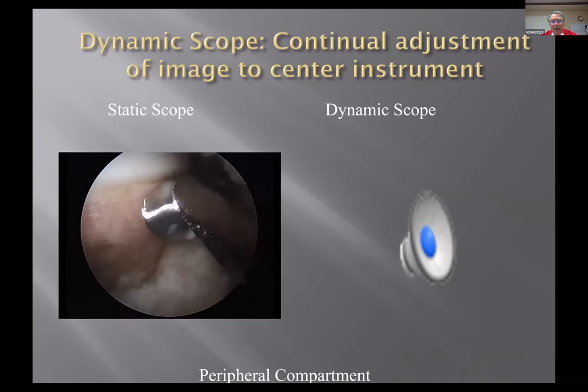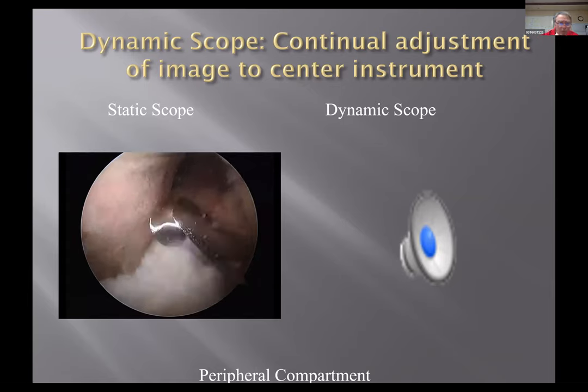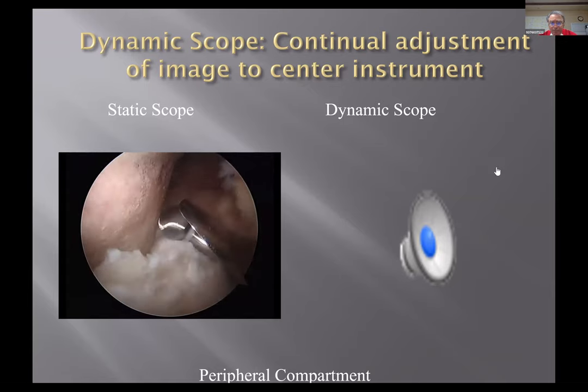Some people will tell you that as your scope is not moving, a static view doesn't give you the ability to move with the hip. So on the left is a static, I'm not moving my scope.